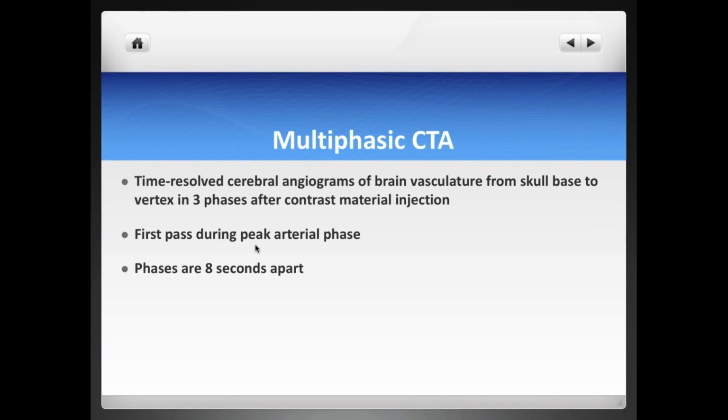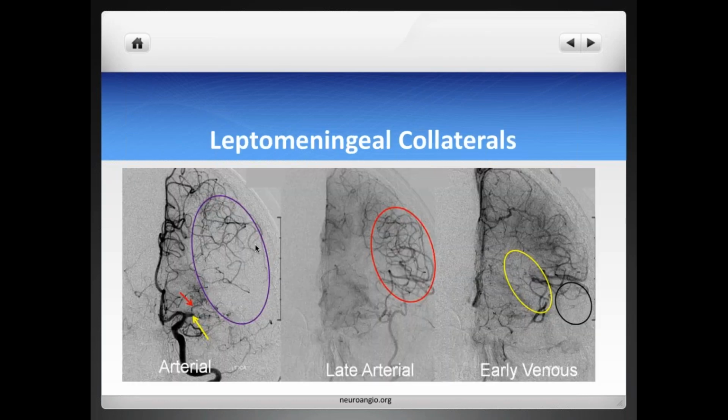Multiphasic CTA has been favored. Some good research has been done on that, including a very seminal radiology article that came out in the last couple of years. With multiphasic CTA, basically what you do is similar to what we would do in other parts of the body, such as the liver. You look at different phases of the CTA. You do one injection, and then you do another couple of acquisitions in the venous and late phases, 8 seconds apart. The whole objective of multiphasic CTA is to look at the collaterals, those leptomeningeal collaterals that we are talking about here.